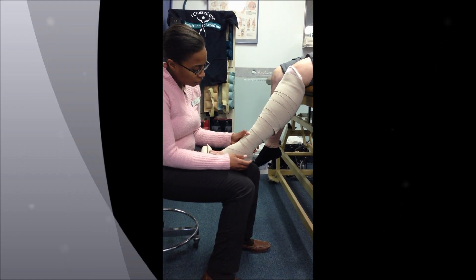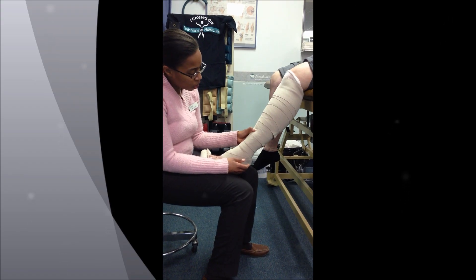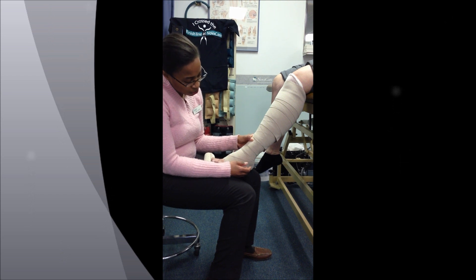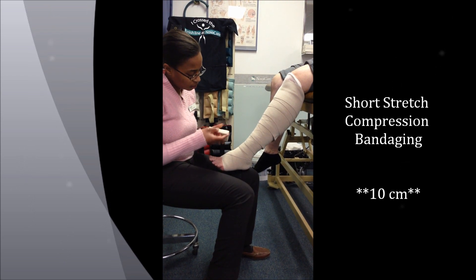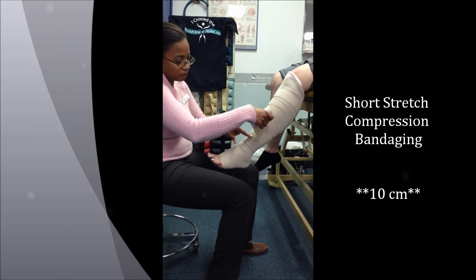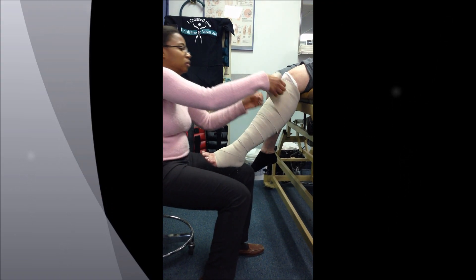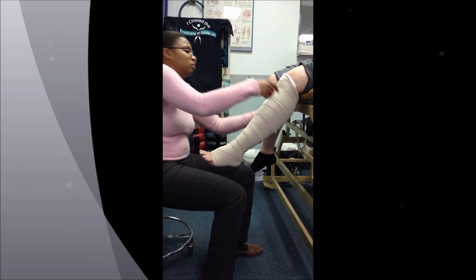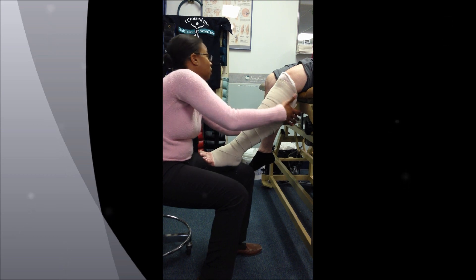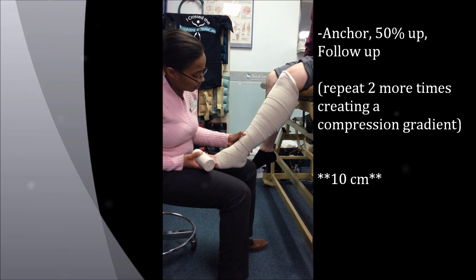So in doing that, what you're going to do is feel around for where it feels more hard versus soft. In this position here it's feeling pretty hard, then it gets a little soft. Once you feel that soft spot, that's where you start your next roll. So again, anchor, 50%, follow up, and follow the same idea for your last two.